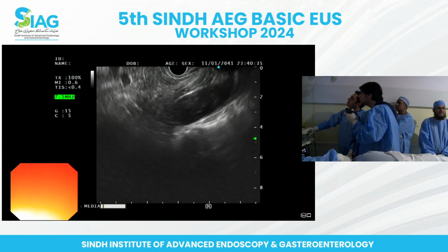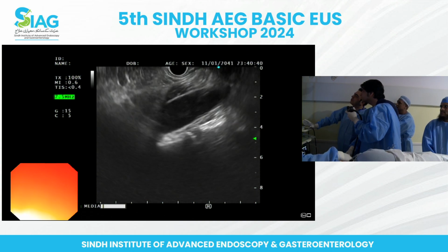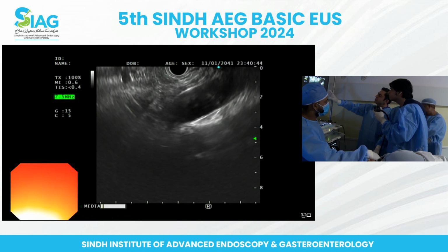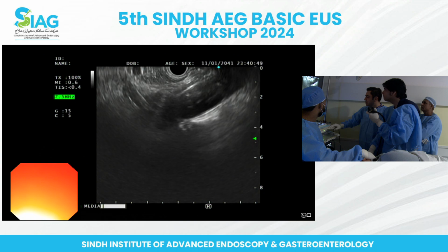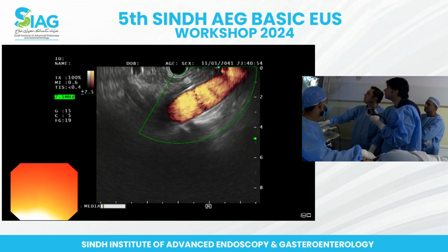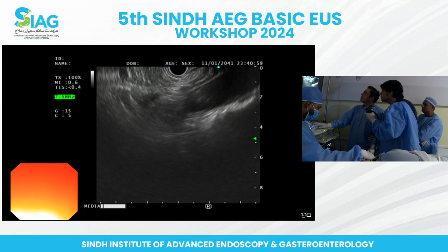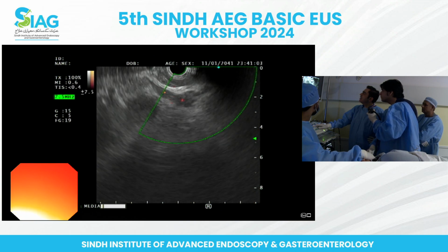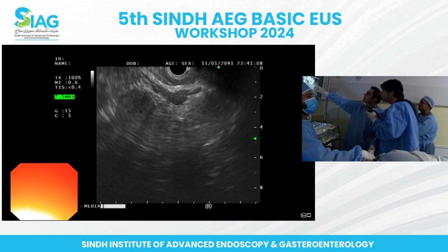So see now, pull back on the aorta. You just want to get the first vessel. Okay, that's fine. So we now know that we are roughly in the crux of the diaphragm, you can see there. Now we need to find the first vessel that comes off it. It was coming a bit on view, so you can put some Doppler on it if you wish, just to see that we know you're on a vessel. So yeah, keep on pushing the scope in gently. Yeah, excellent. You can see the celiac axis coming off there, isn't it? That's the first vessel that seems to be coming off.